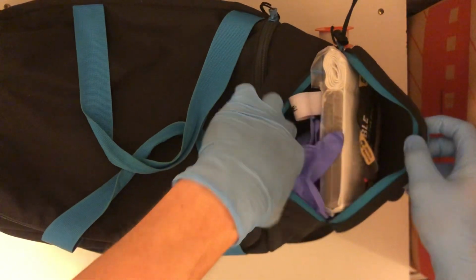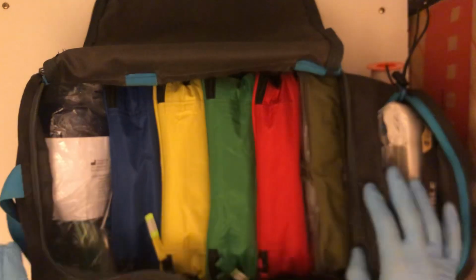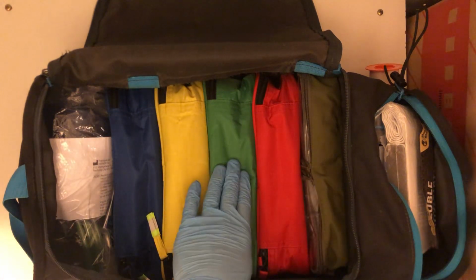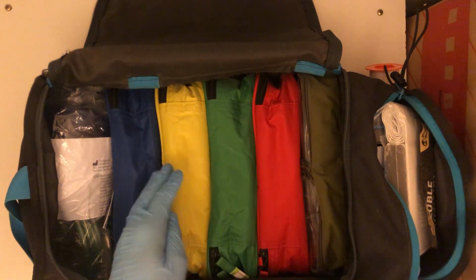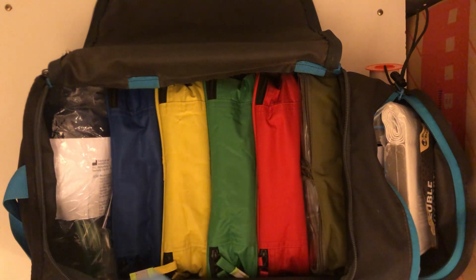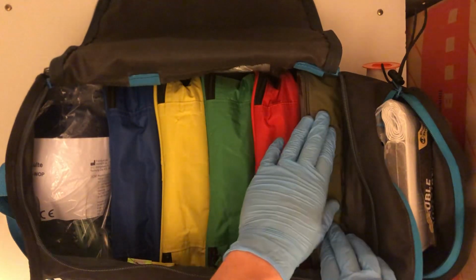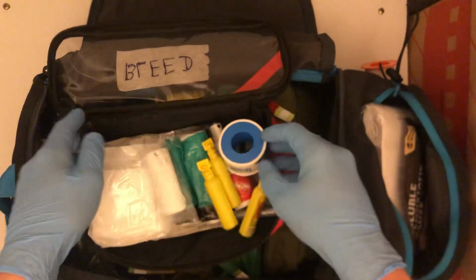So there you go. Then, as for the big compartment, I built specialty kits. The red one is for wounds. Yeah, red means blood. Then the green one is for burns. The yellow one is for ortho emergencies, so broken bones basically. And the blue one is diagnostics. All my airway equipment is going to be on the sides of it. And this is IV. So, as we go, you get your boo-boo kit, basically.